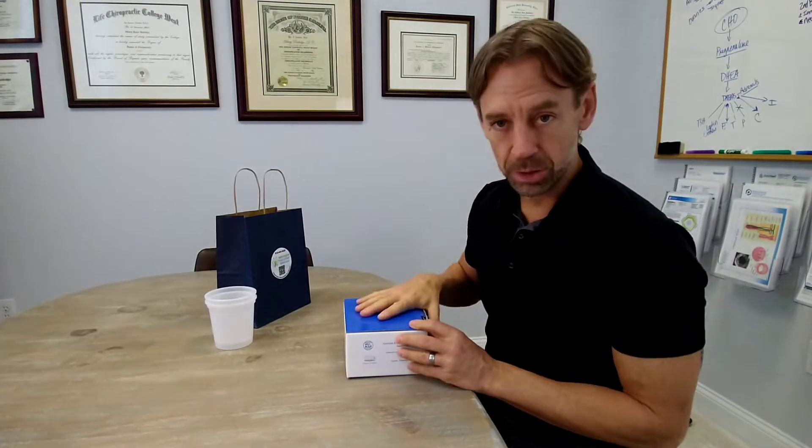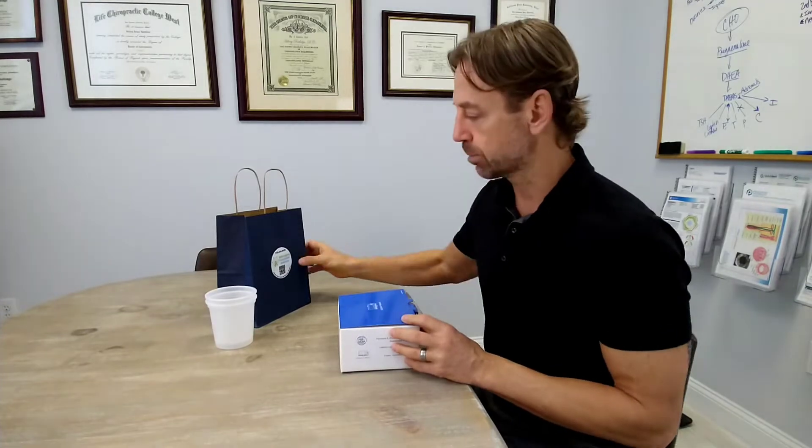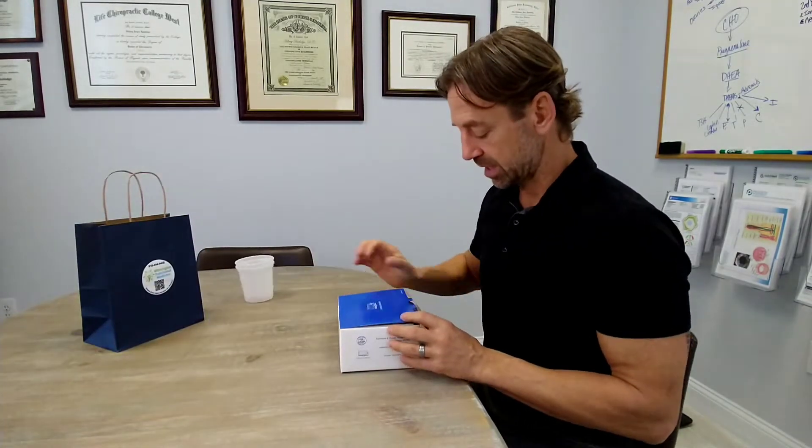More than likely it does say HU-MAP, but just in case you were given the wrong test or wrong video, make sure that the instructions you're watching match the box you were given. Now let's dig into this box. Put the bag aside and the cups aside.